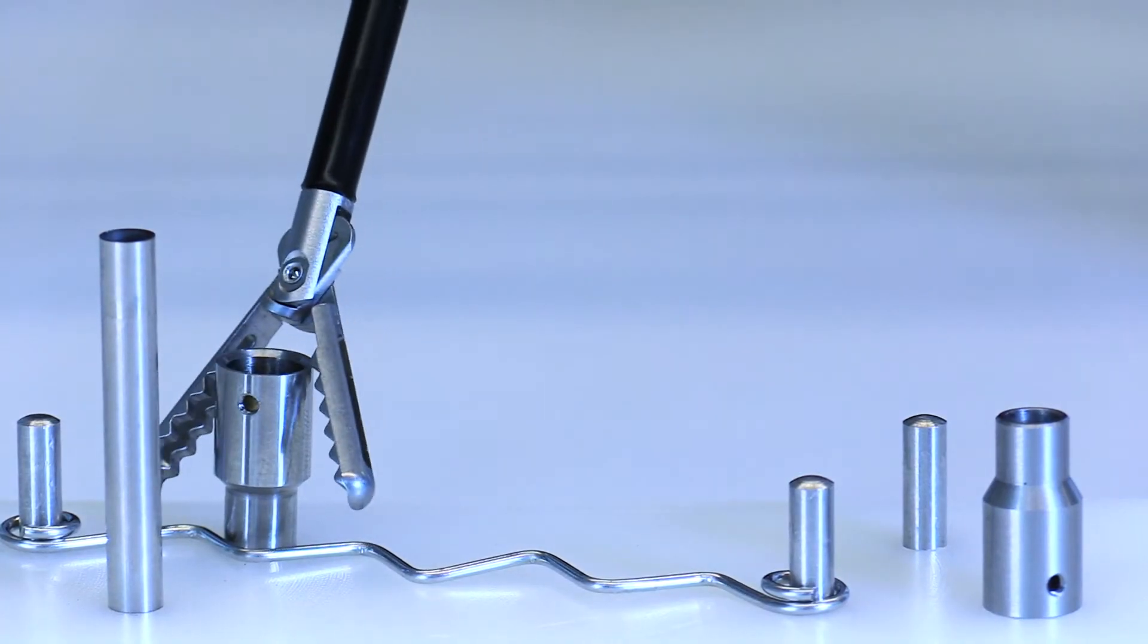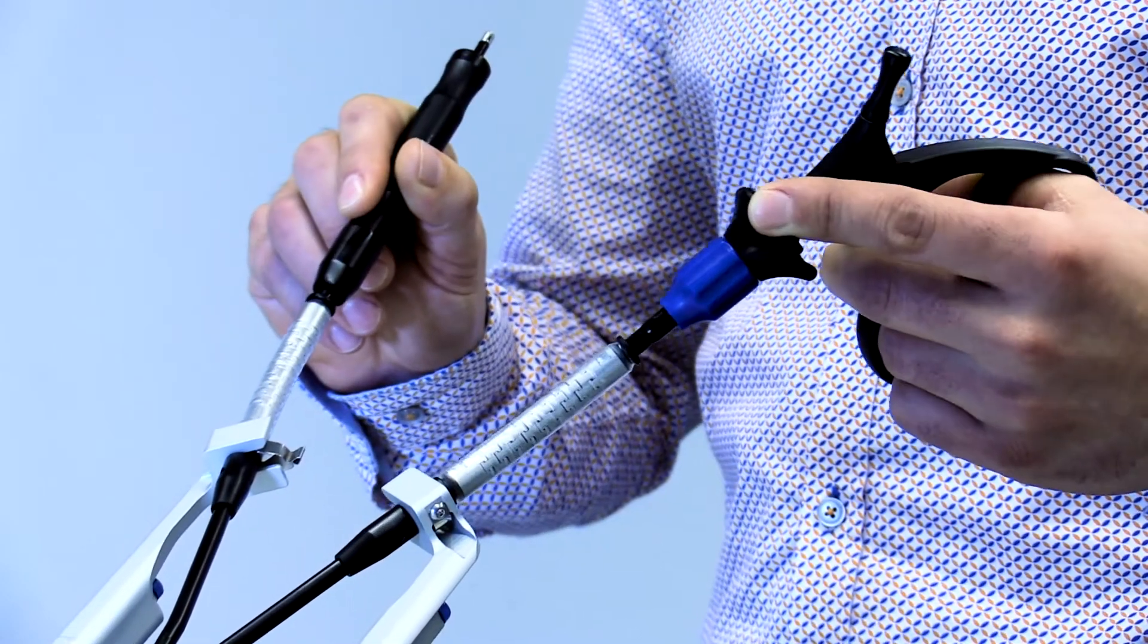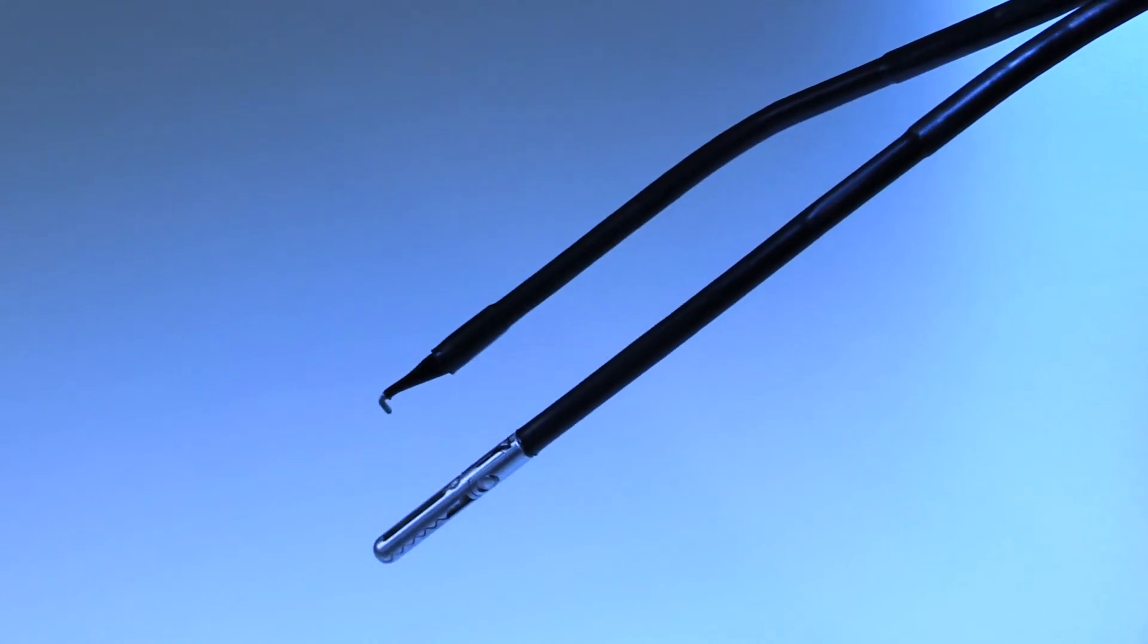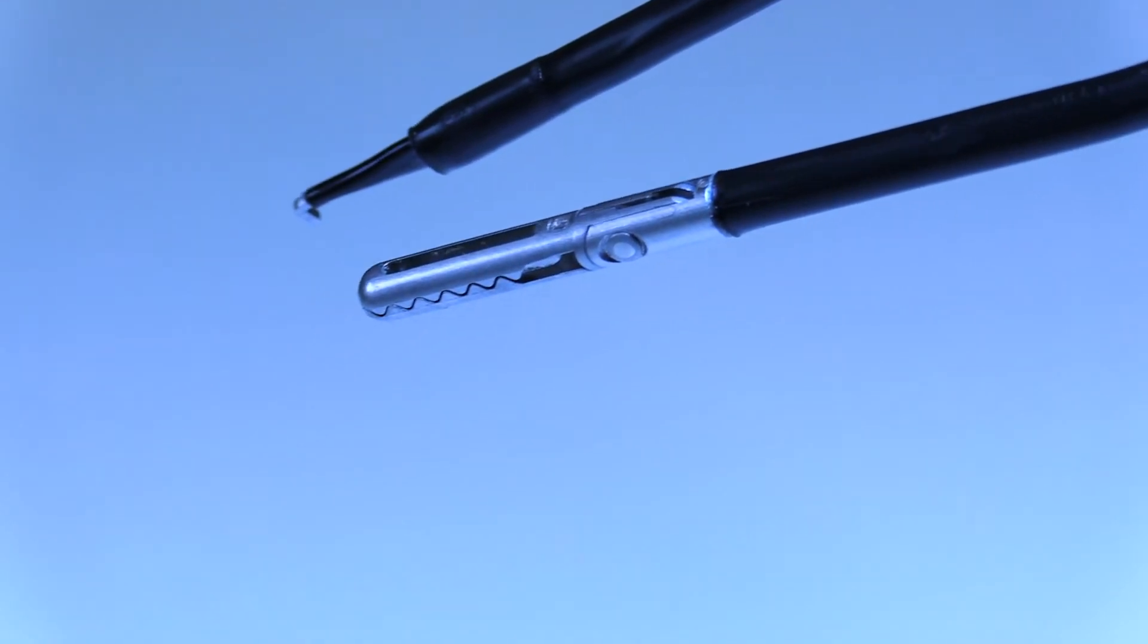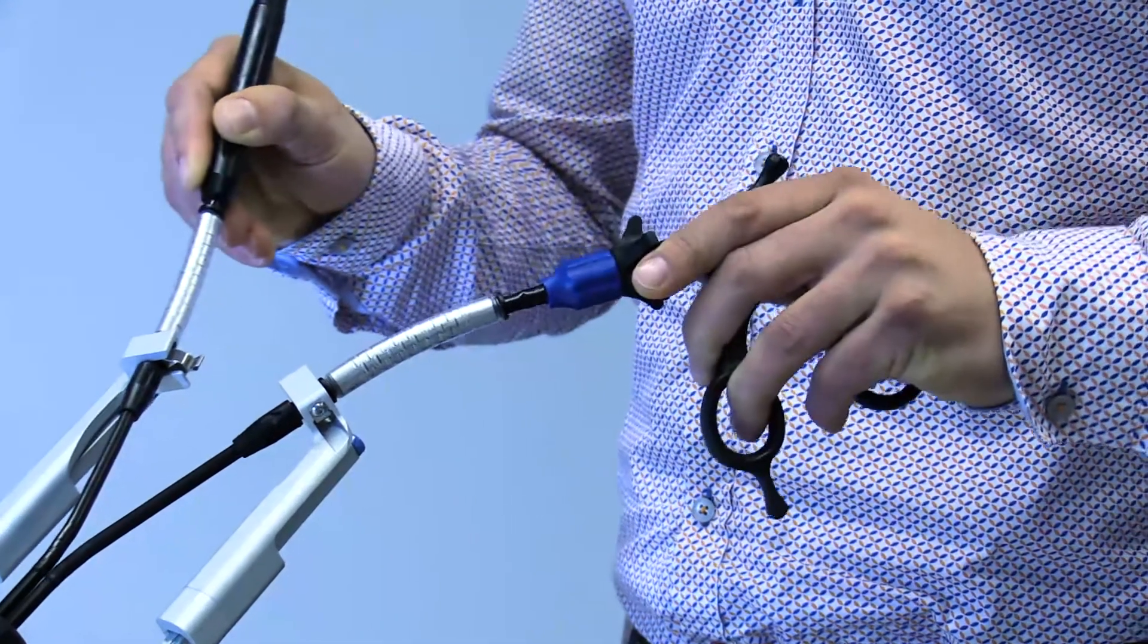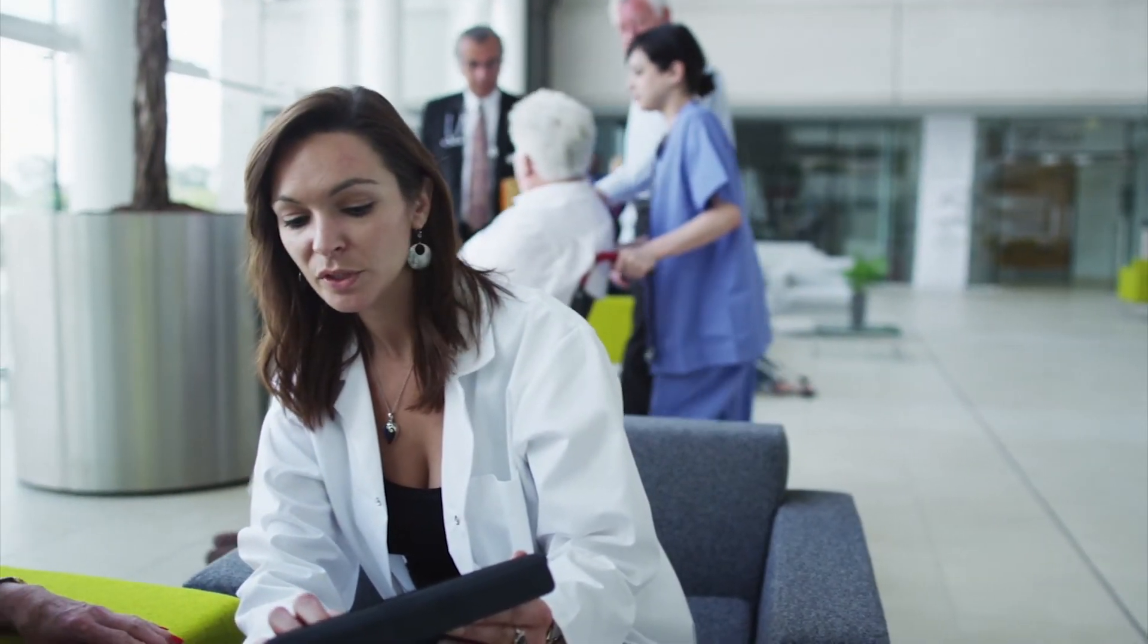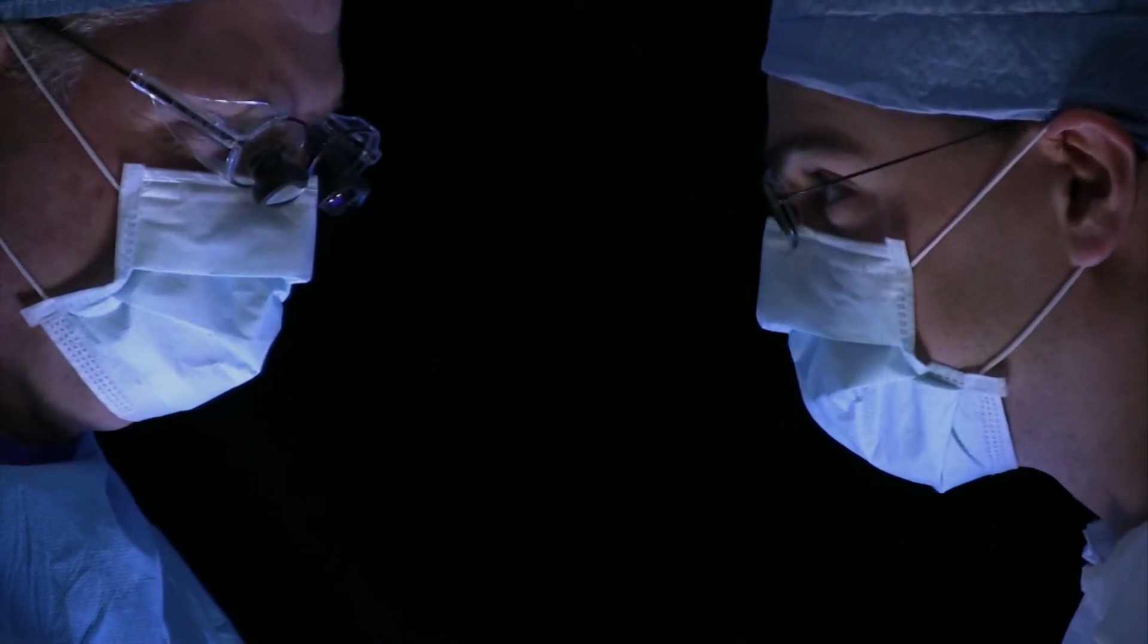Its breakthrough technology fully emulates conventional laparoscopy from handling and triangulation to articulation. The right hand controls the right articulating instrument and the left hand controls the left articulating instrument without instrument inversion or collision, improving overall procedural efficiency and ergonomics. This makes Symphonics easy to use and enables surgeons to perform single port surgery safely and comfortably.